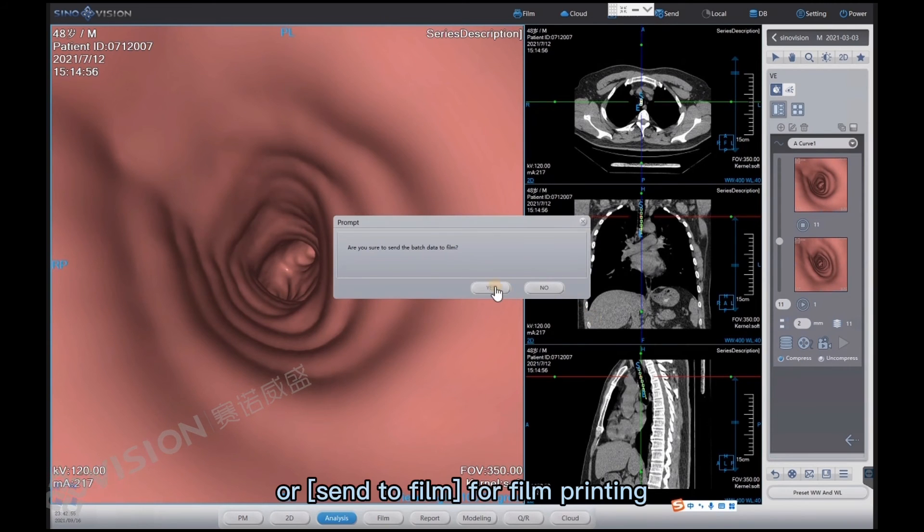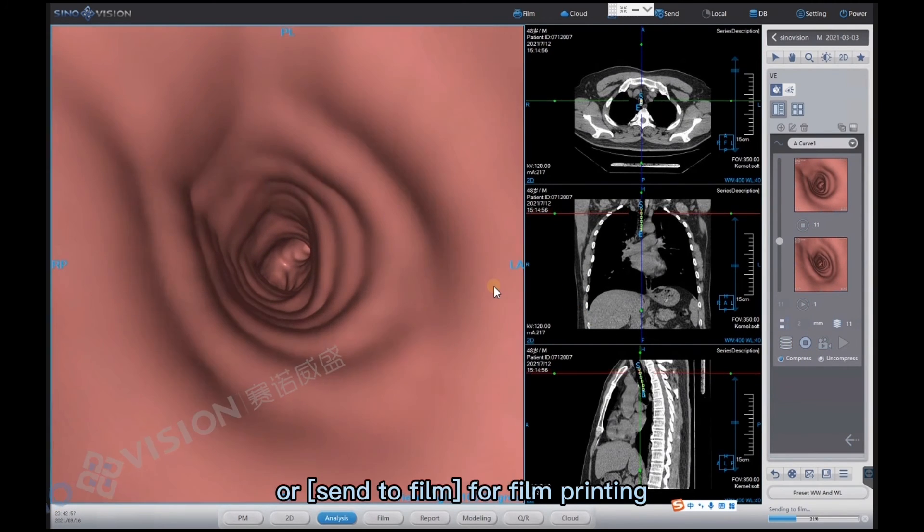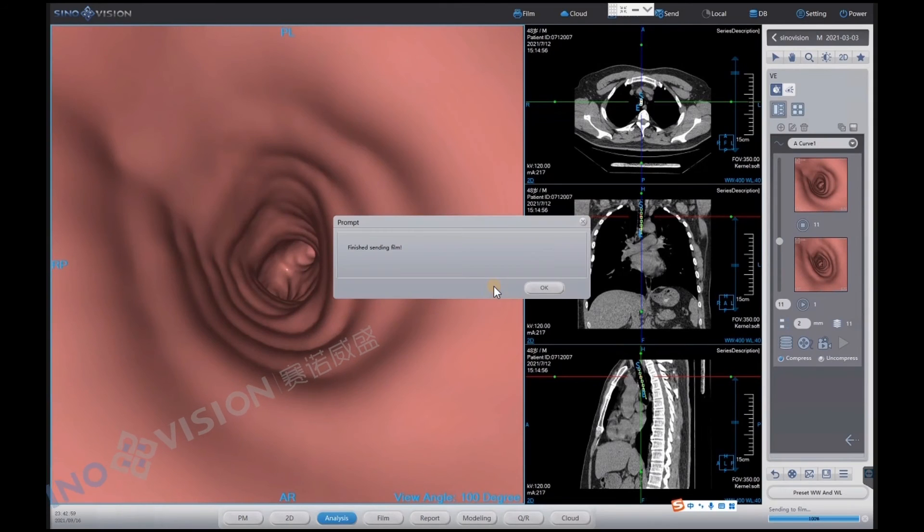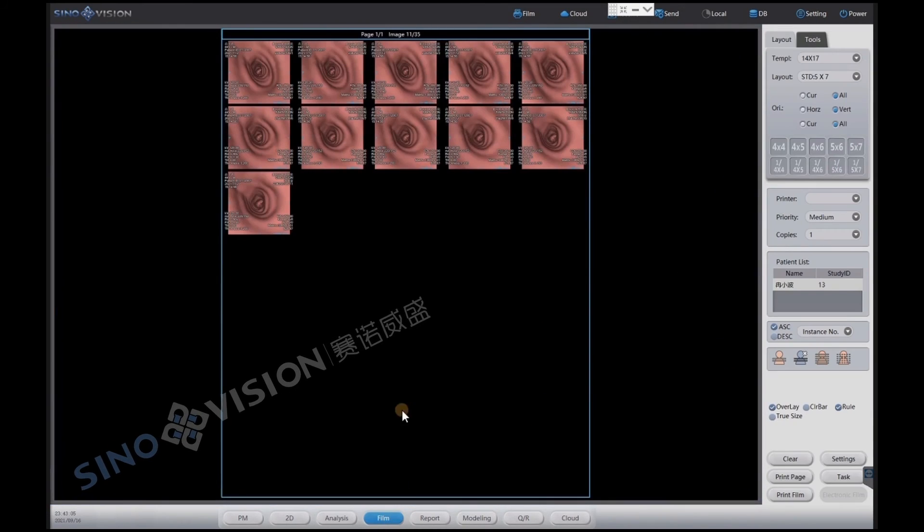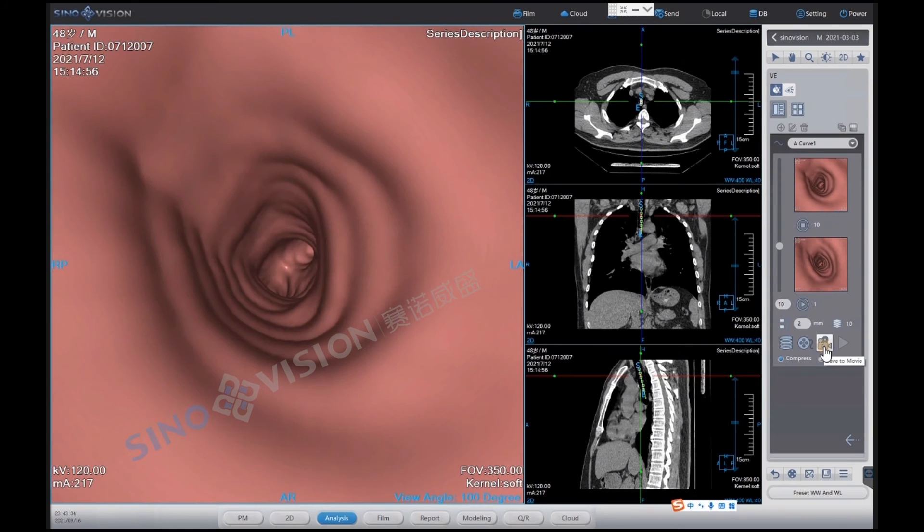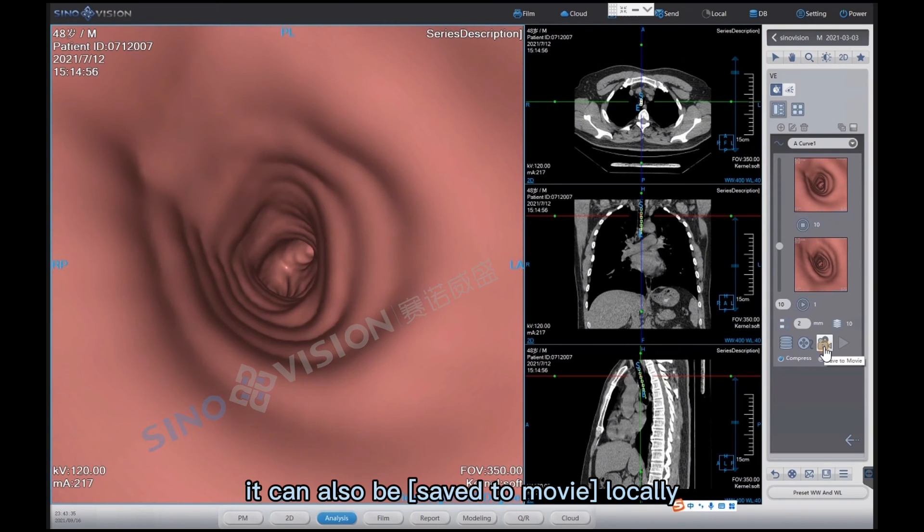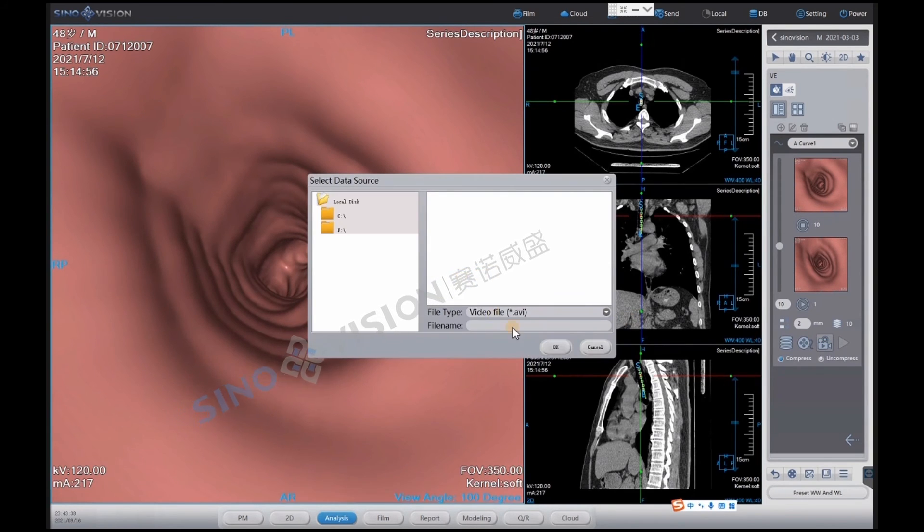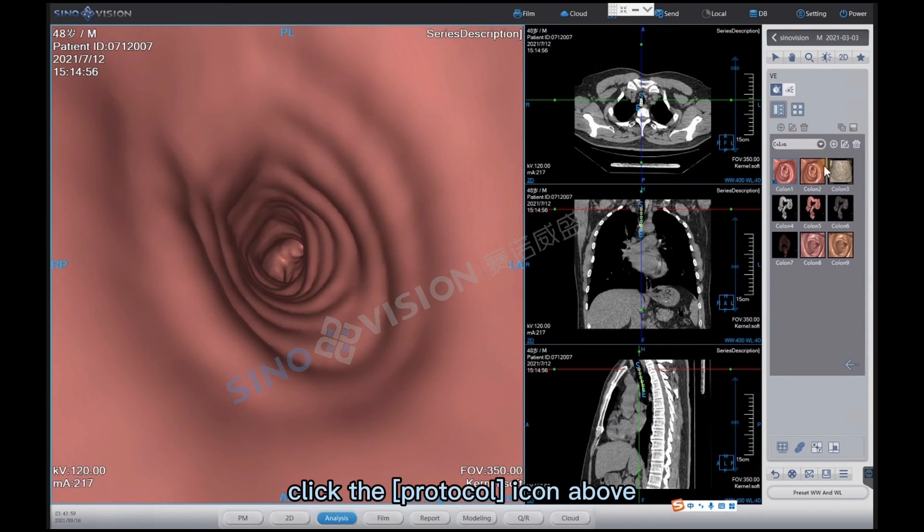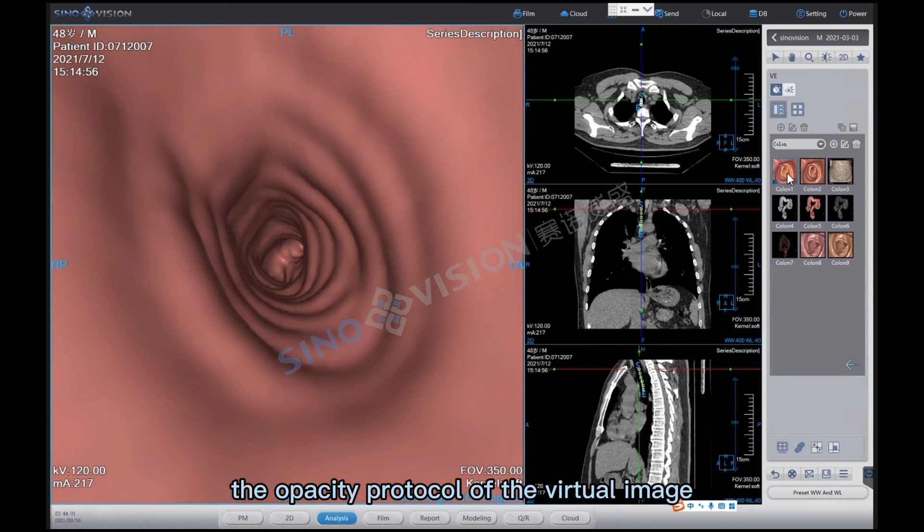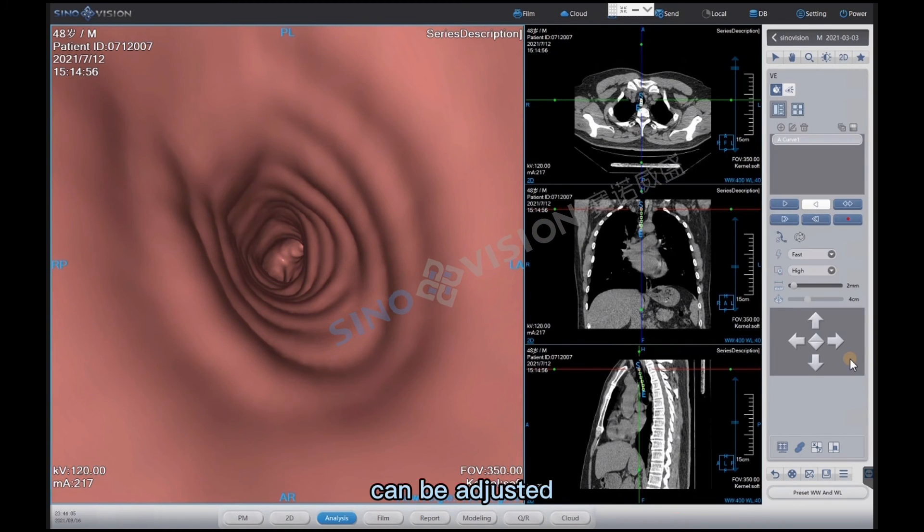Click the save to database icon to save images to the database as needed, or sent to film for film printing. It can also be saved to movie locally. Click the protocol icon above. The opacity protocol of the virtual image can be adjusted.